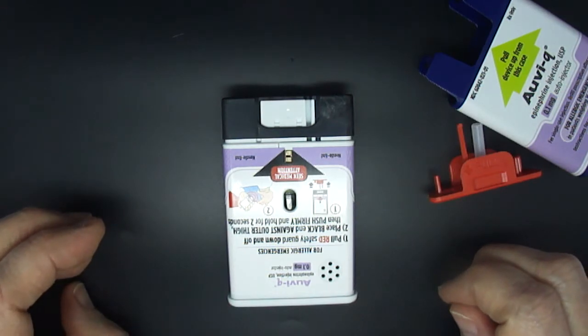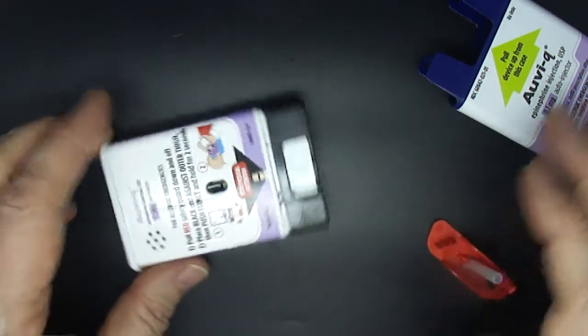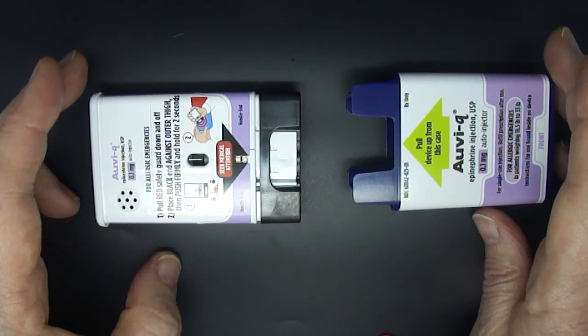Seek emergency medical attention. This Avi-Q has been used and should be taken to your physician for proper disposal and a prescription refill.